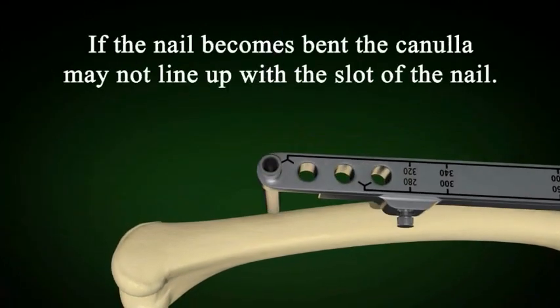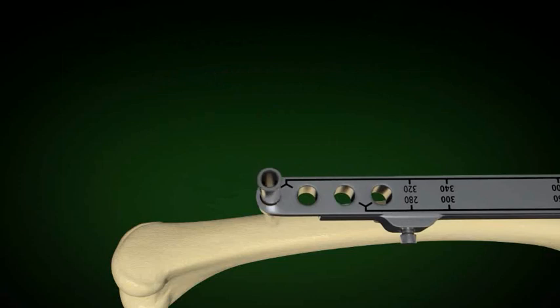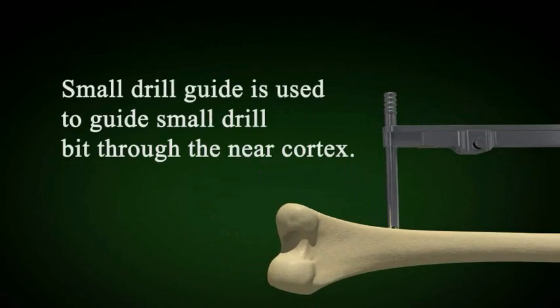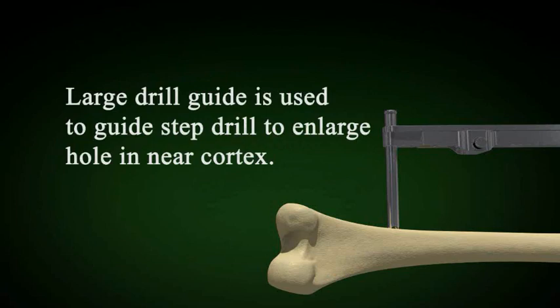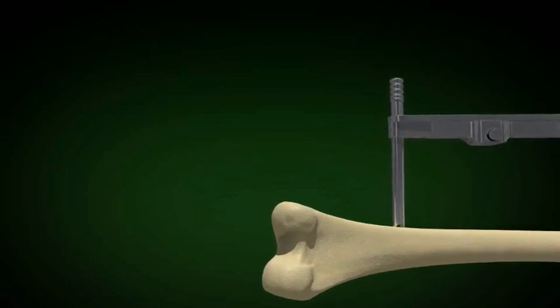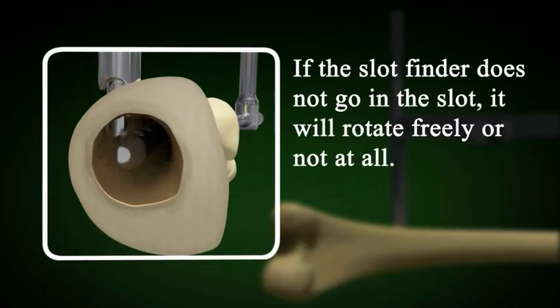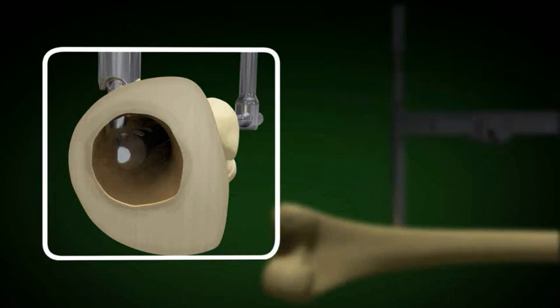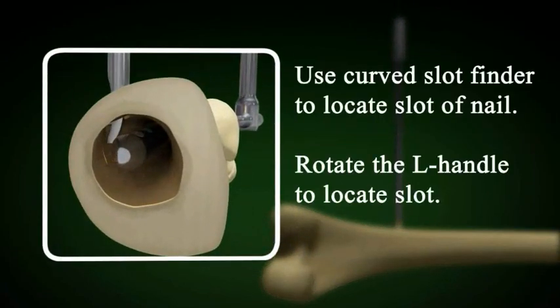If the nail becomes bent, the cannula may not line up on the bone. Adjust the target arm so the cannula rests on the bone: remove the cannula, loosen the adjustment screw, and realign the target arm. Use the small drill guide to drill a hole in the near cortex, then use the large drill guide to enlarge the hole with the step drill. Use the solid slot finder to locate the slot in the nail. If it does not go into the slot, it will rotate freely or be stuck in the hole. Remove the target arm and use the curved slot finder to locate the slot.